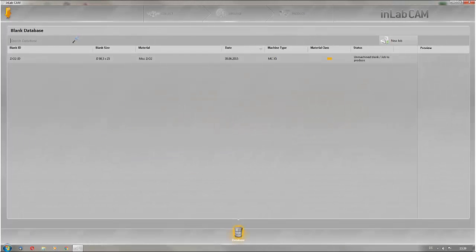Welcome to this tutorial on InLab CAM Software 15. This video explains the configuration options of this software.